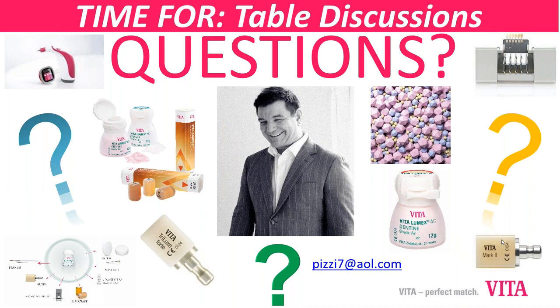So I don't know if I get the reasoning that we're dying to make a zirconia veneer. It doesn't do anything for me besides create more challenges at this point. So as of today, I have no interest in zirconia veneers. Down the road, you might hear me say something different as the materials keep evolving. But right now, I have feldspathic, lithium silicate, and lithium disilicate, and I could layer on all of them or mill them monolithically. And that's a lot of options for me.